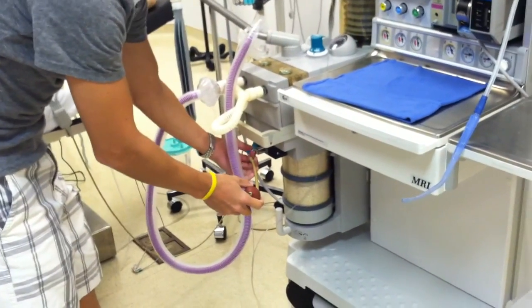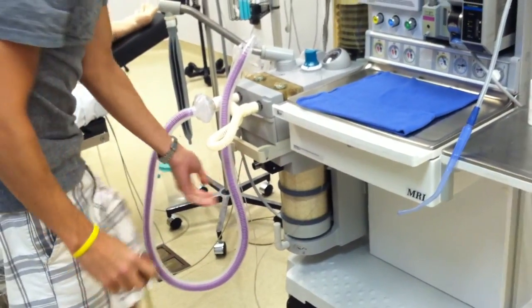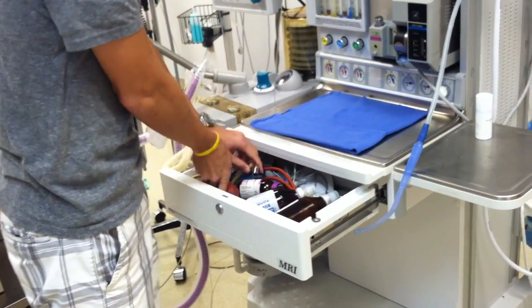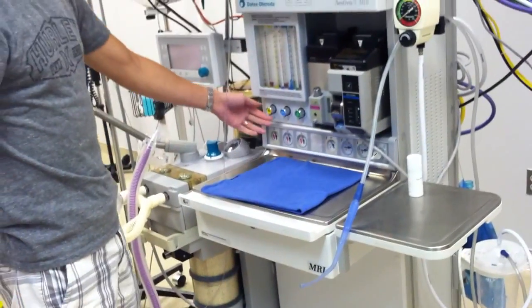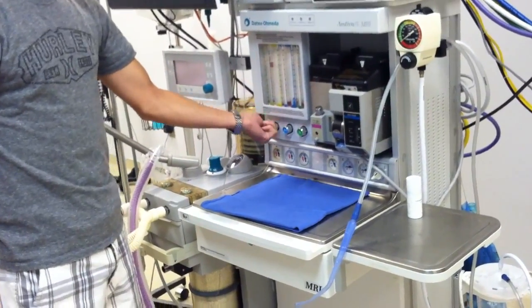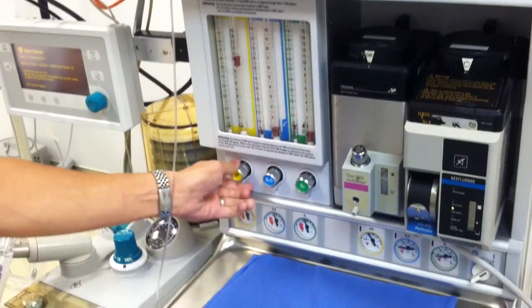Once we're done with our low pressure check, just pull this out — but make sure you close this green lever. Put the bulb back. That completes the low pressure check. Now we can turn on the machine and go ahead and check our flow meters first. You want to take them all the way up to the top, bring them down, and make sure they don't get stuck anywhere.